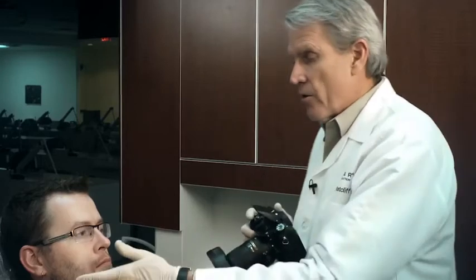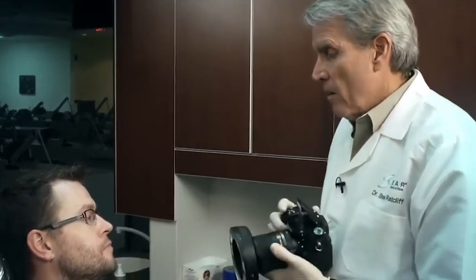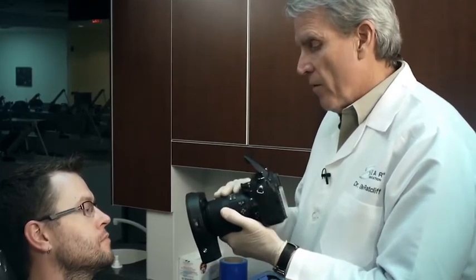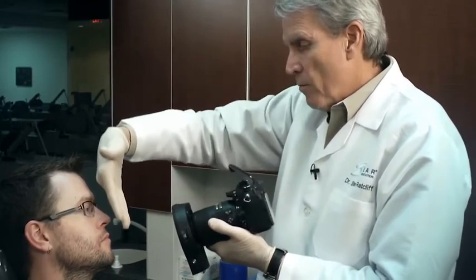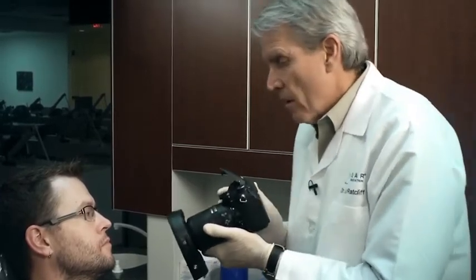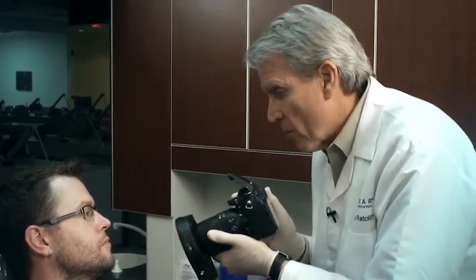I want to be able to see the relationship of the upper lip to the teeth when they give me a big smile. So Scott, turn towards me. And the same rule applies here. I want the lens of the camera to be perpendicular to the facial plane of those front teeth. So Scott, give me a big grin. All you got, all right?